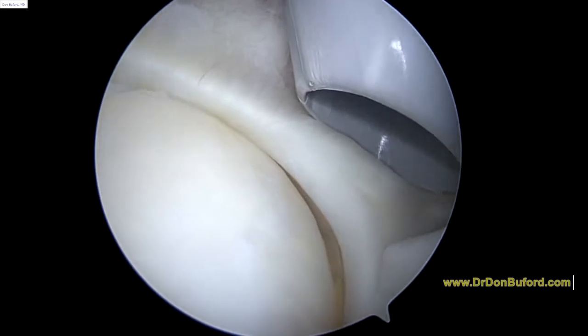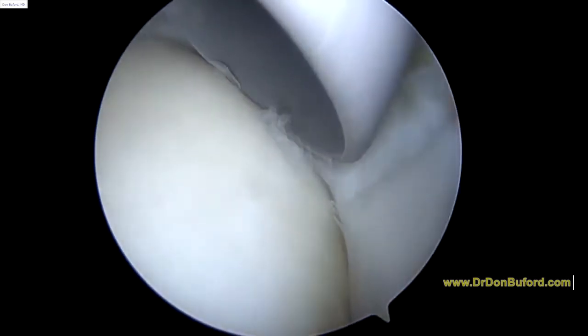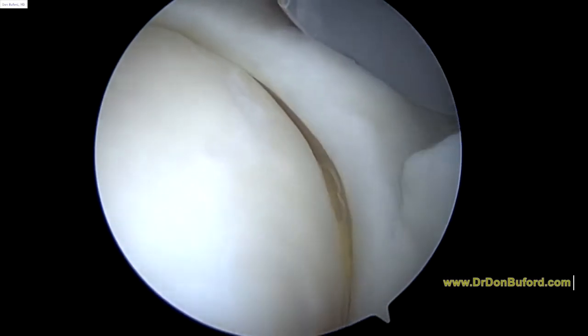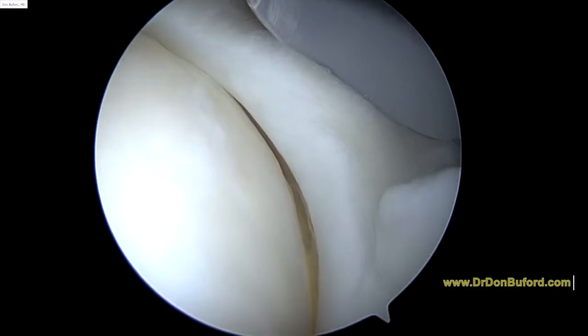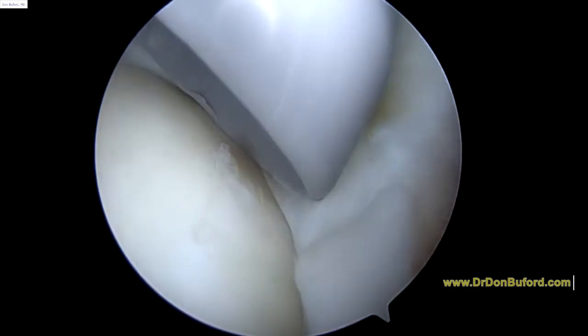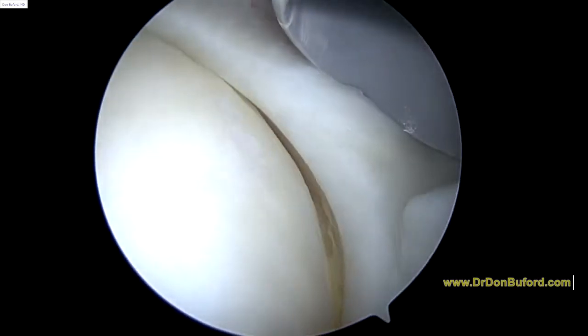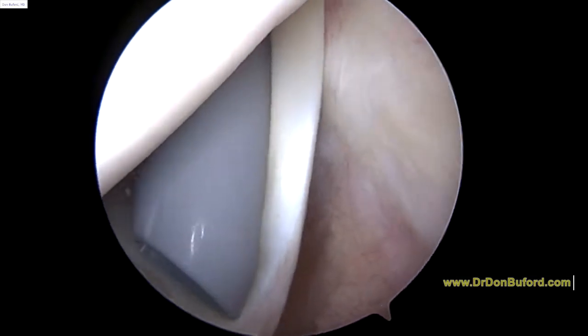Although on an MRI scan, this may show as having a sulcus, because you can see as we displace it, there's a little bit of a gap there. Okay, but again, no signs of any chondral injury or trauma, and the soft tissue of the labrum looks normal too. So this is an example of an MRI scan that may be read as a SLAP tear that really is not.